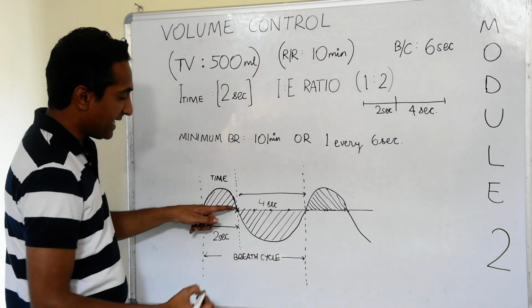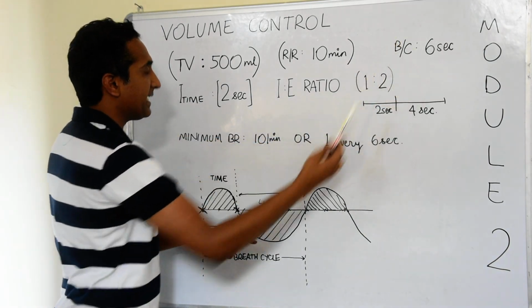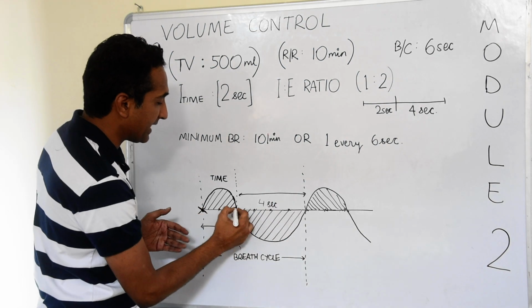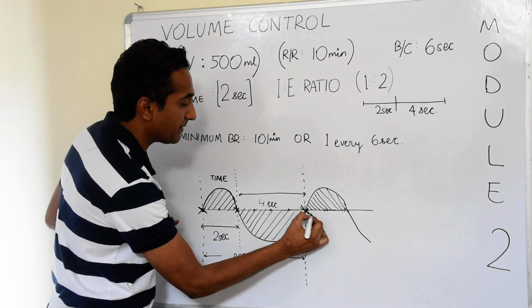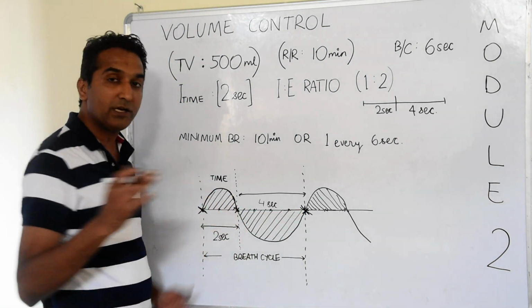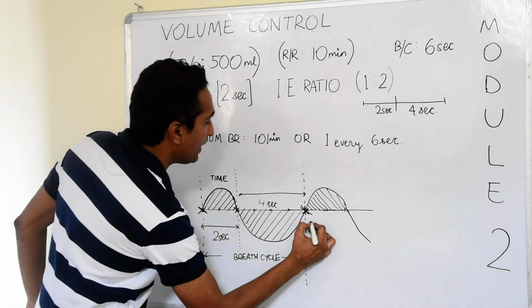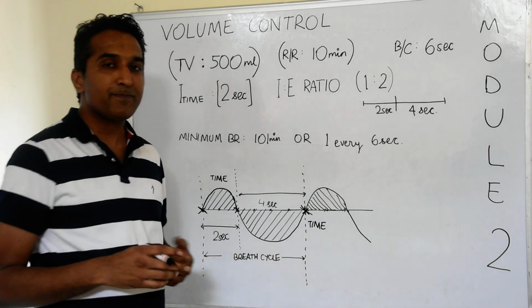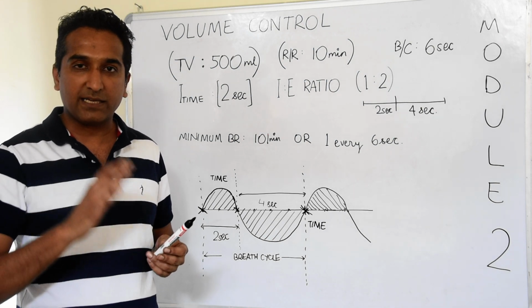After that, the expiratory phase starts, and according to a breath cycle of 6 seconds, 2 seconds have already gone into inspiration. So for another 4 seconds, the expiration will continue. Now a new breath has to start. We know that this new breath is starting because a particular time has passed, and so we could call it a time triggered breath, which means every 6 seconds a breath will start, which will start the inspiration.